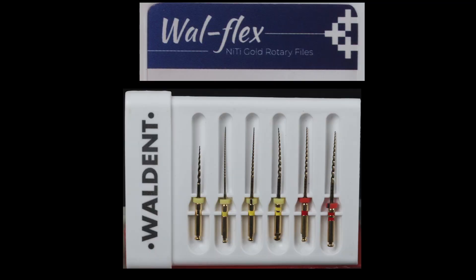If there is anything negative, I would like to pinpoint the color coding: the 19/0.02 rotary glide path file and the 20/0.04 file both have a single yellow ring, and the sizes are not engraved on the shaft either. For an experienced clinician, differentiating by file thickness is manageable — the 0.04 file is noticeably thicker — but for a beginner this might be a little confusing. Apart from that, I couldn't find anything greatly negative in the short span that I've used these files.